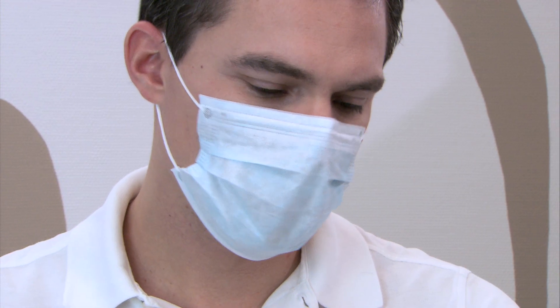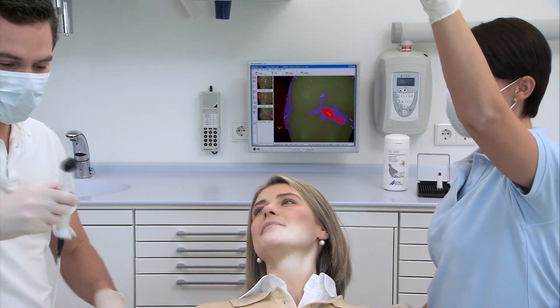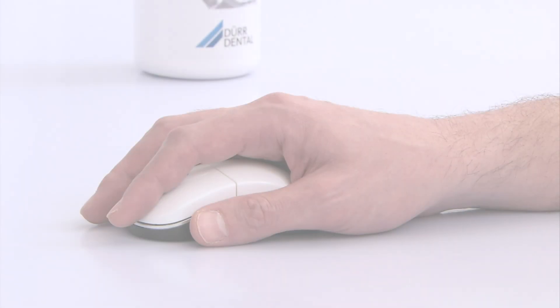The greater the density of the bacterial community, the brighter the illumination. Even caries lesions in the very earliest stages can be precisely located and evaluated at the same time. The software analysis not only enables localization, it also determines the extent of caries activity using a numeric scale.